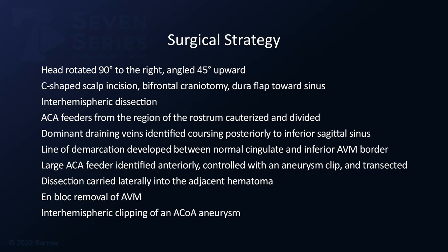Identification of dominant draining veins coursing posteriorly to the inferior sagittal sinus. Development of a line of demarcation between the normal cingulate and the inferior AVM border. Identification of a large anterior cerebral feeding artery anteriorly, which was controlled with an aneurysm clip.